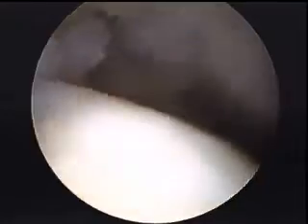So I'm happy with this. Just about done here. We'll take some final pictures, extend his hip out. So now we're bringing his hip out into extension, and you can see again our margin where the osteoplasty was started, normal cartilage there when he is standing straight up. And that's basically the end of our operation.